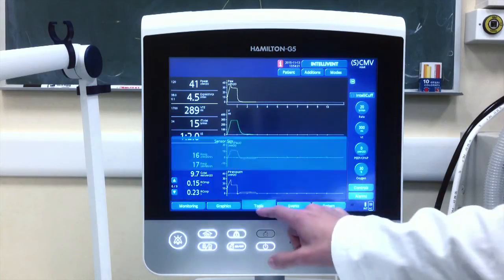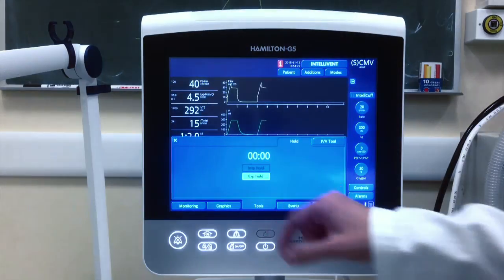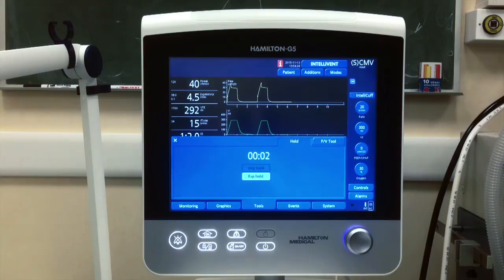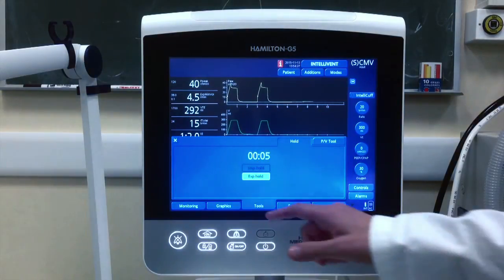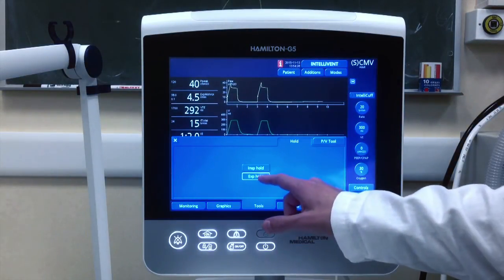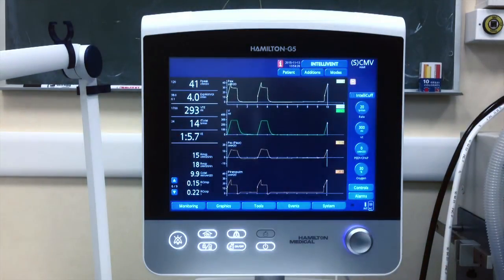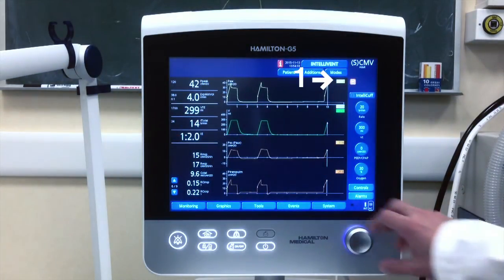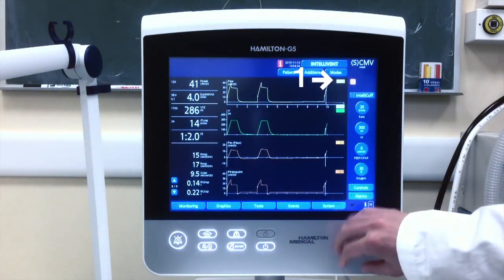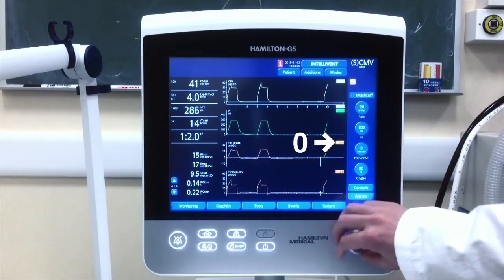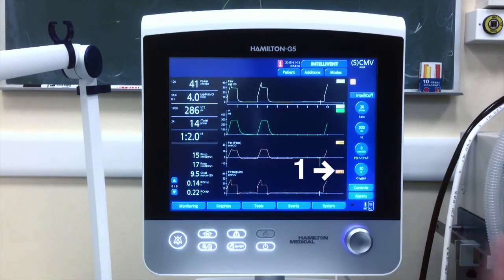Later we need to perform an expiratory hold so that we can measure total PEEP on airway pressure, esophageal pressure, and transpulmonary pressure.